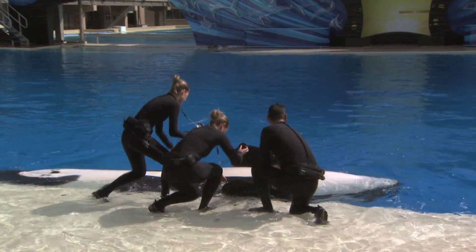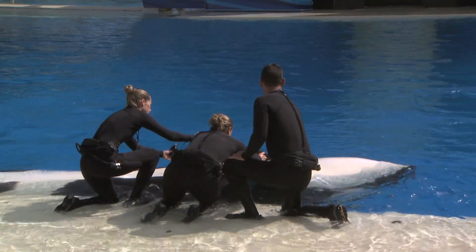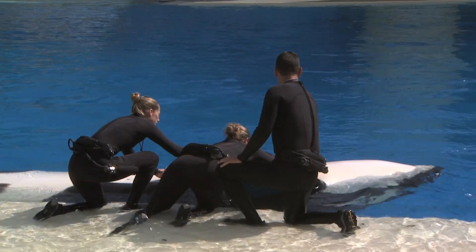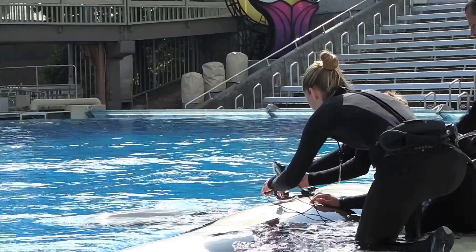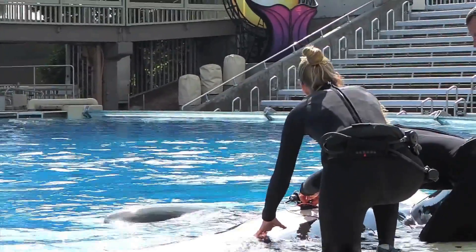Our study here at SeaWorld, where we're developing the technique to actually record the electrocardiogram and look at heart rate, will be beneficial to the veterinarians. The suction cup technology and the electrodes that we're developing will aid them in being able to attach these onto whales and assess them in different situations. By recording the electrocardiogram and the heart rate of these animals while they're resting and undisturbed, it provides a baseline that veterinarians can use to evaluate animals in different situations.